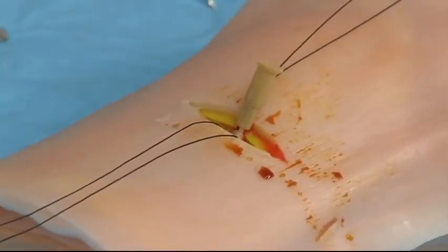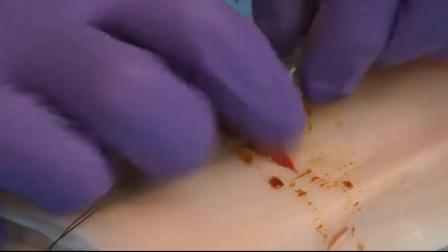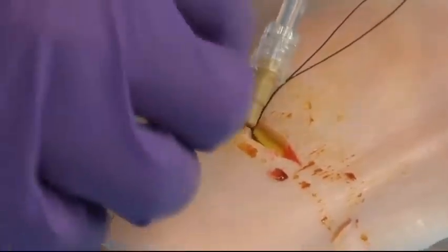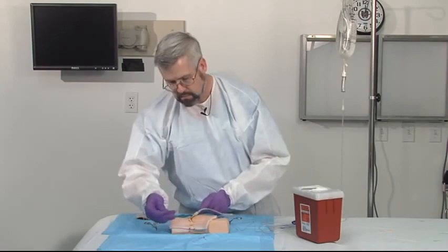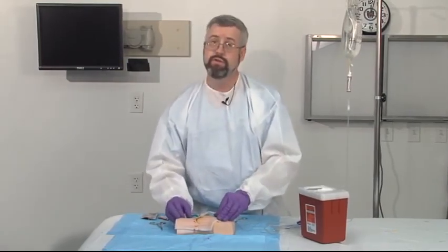Now that's in the vessel. I can now place my IV tubing to this and tie this in place. And we now have a functioning line at the ankle that we can deliver high volumes of fluid to.